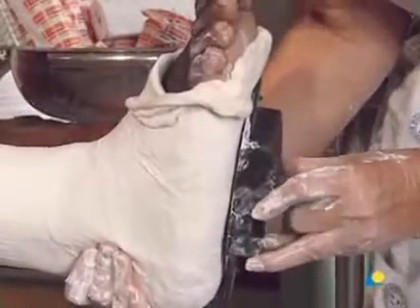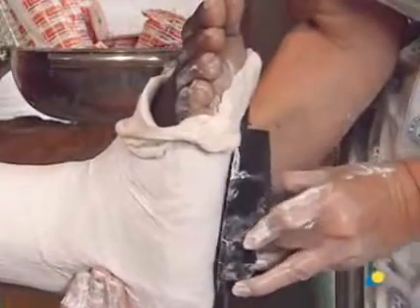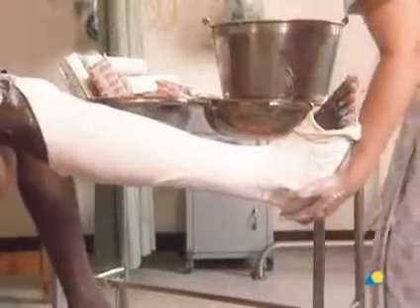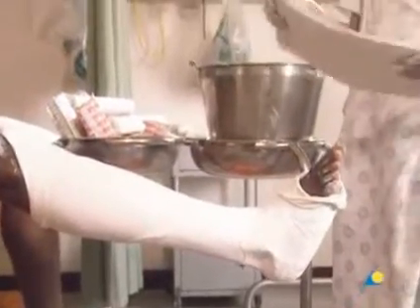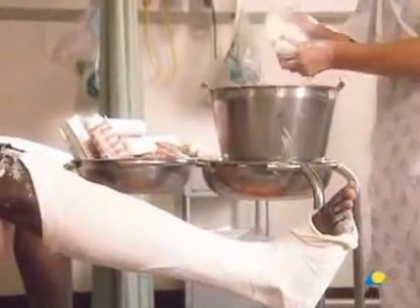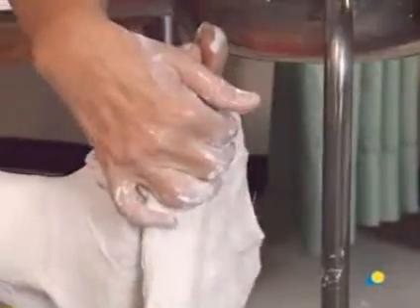To allow weight-bearing, a walking rubber will now be applied. It can be seen that the flat surface of the walking rubber does not lie securely against the surface of the cast. Therefore, a plaster slab is folded over, wettened, placed in between, and molded to ensure the stability of the walking rubber.